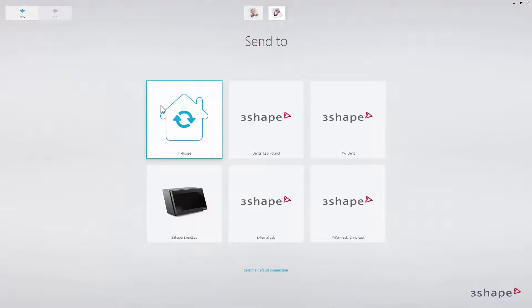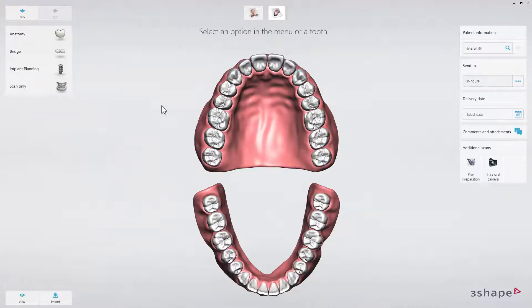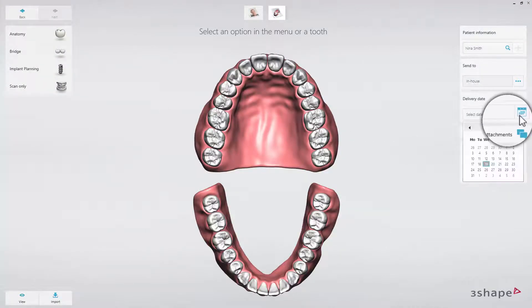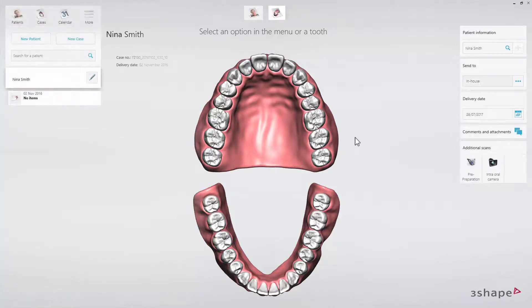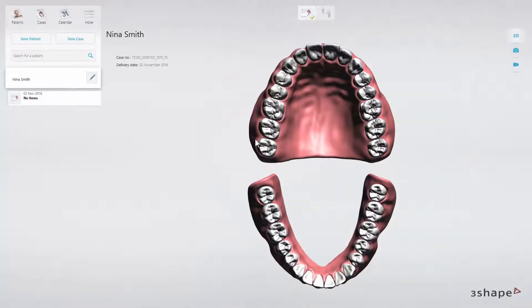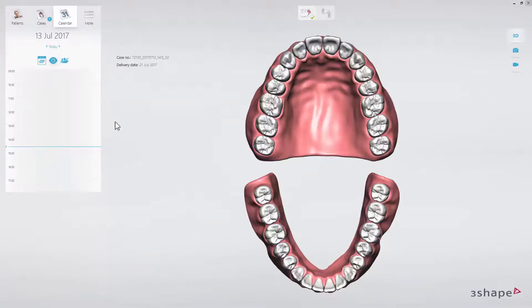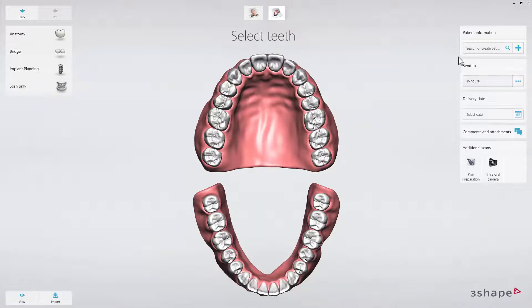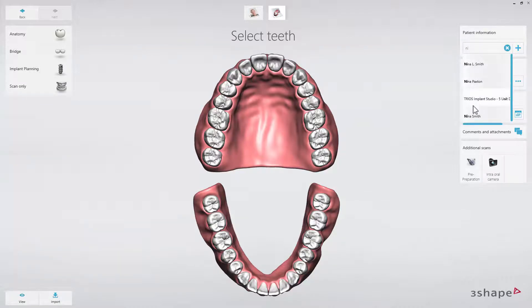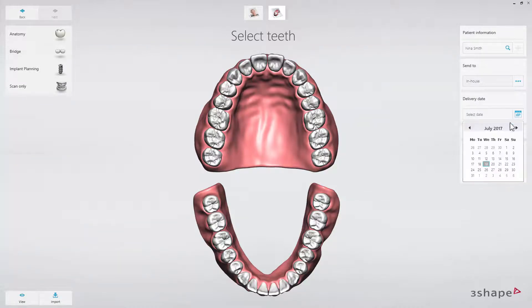Start by choosing which partner the case should be sent to and a delivery date for the case. If you prefer to create cases using the calendar, click on the calendar icon and select the time slot. You will then choose the partner you wish to send the case to, choose an existing patient or create a new one, and fill in the rest of the details.